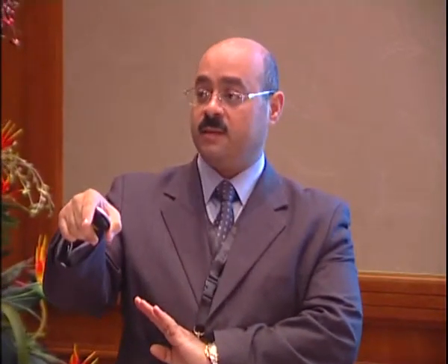And there is something called Emulate in the machine, where if you want to work like an Erbium YAG, you push a button and it will give you the thermal model of the Erbium YAG, which is more ablation and much less coagulation. If you want to achieve the effect of the YSGG, where it has balanced ablation and coagulation, you push the button and it will give you the balanced ablation and coagulation. If you want to work like a CO2, then it will give less ablation and more coagulation. So with one device, you can have whatever thermal model you might achieve with any other device. This is the objective here.